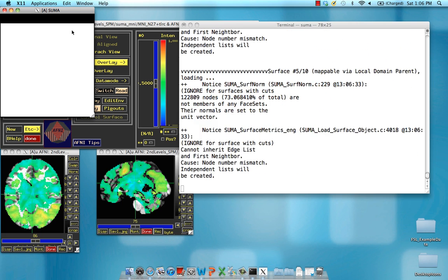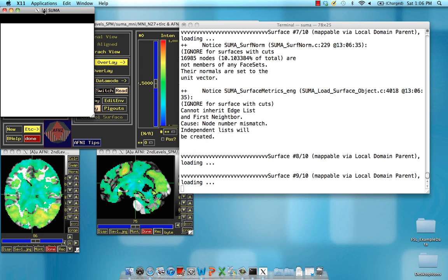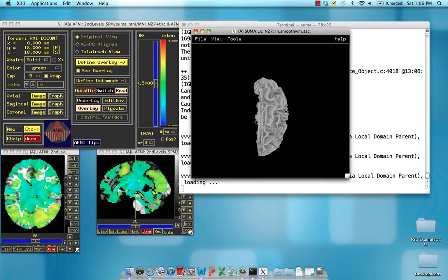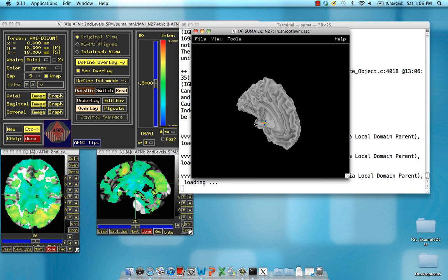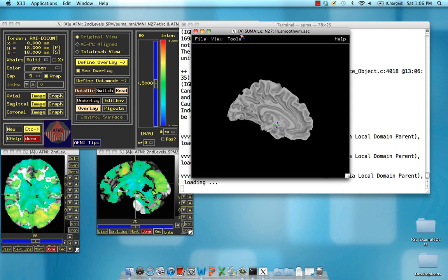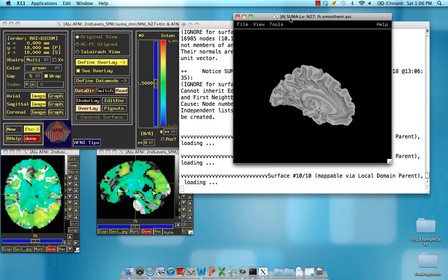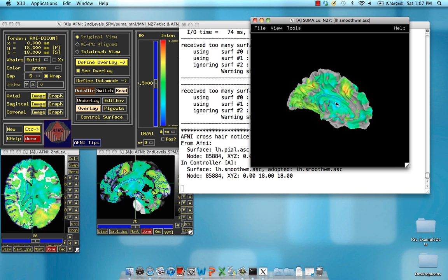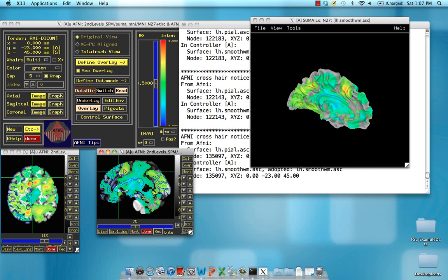Now SUMA loads. I'm going to expand this a little bit to make it more manageable. This is our 2D surface area; this is 3D volumetric, and this is 2D surface. Click in this window and then hit T for talk, which will allow these two to communicate with each other. Now we have the results mapped onto a surface, and as I move the cursor around here, the crosshair correspondingly moves around on the surface.